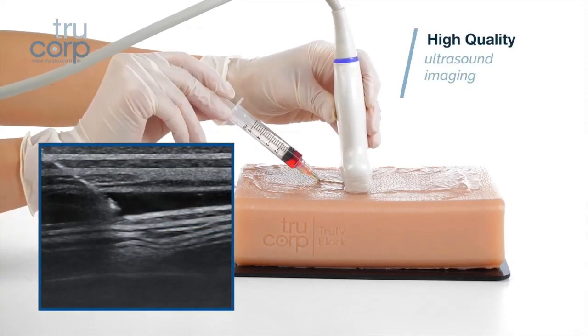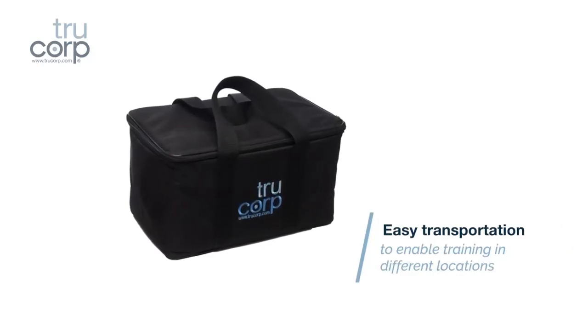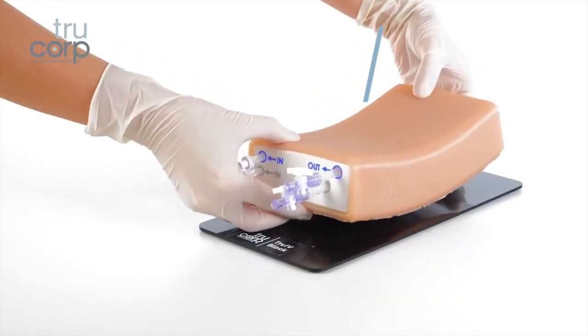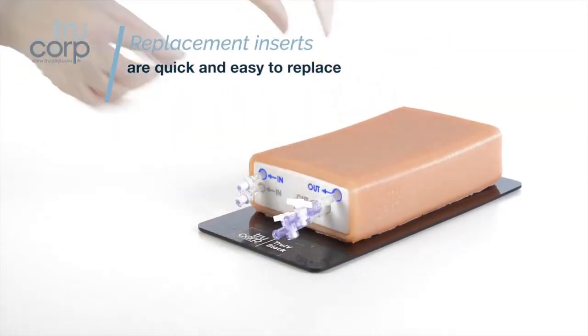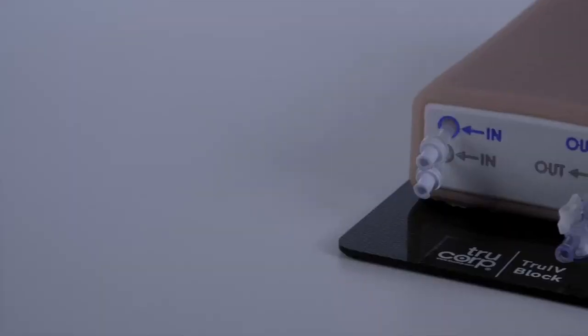Setup time is less than five minutes and users will benefit from high quality ultrasound imaging, delivered in a compact carrier case for easy transportation to enable training in different locations. Replacement inserts are easy to replace with no disruption to teaching time.